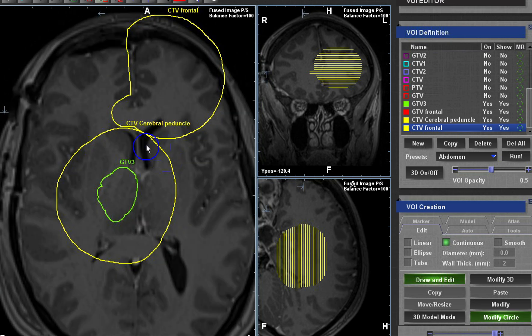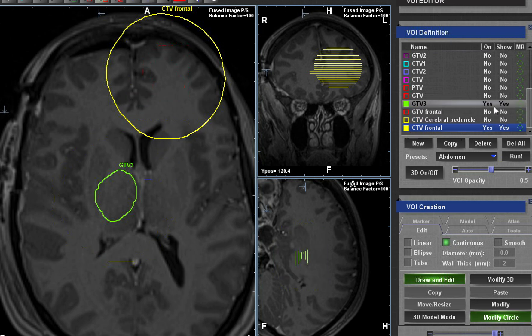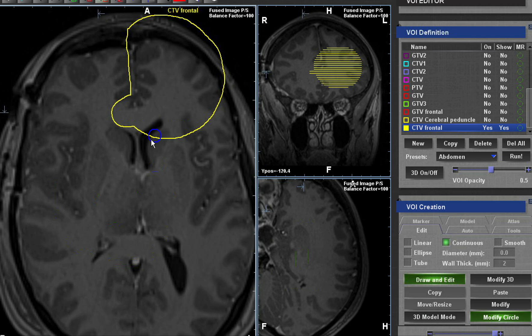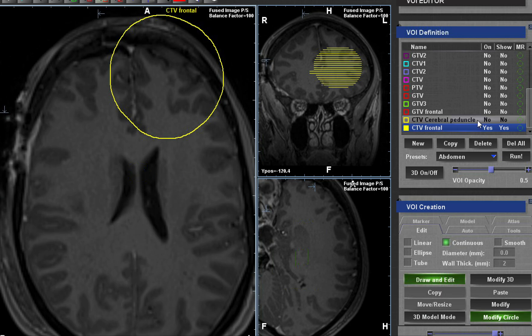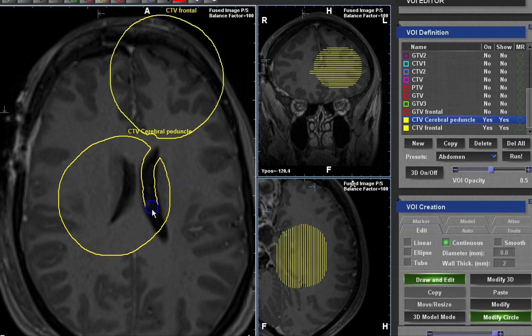Trimming at the ventricles can sometimes be overdoing things. If you trim following NRG guidelines you would trim the ventricles, but I would not do that — first because I don't want to compromise corpus callosum coverage, and second because I want the sub-ependymal tissue to be included. The EORTC recommends a half-centimeter margin around the ventricles. I usually remove the ventricle on the opposite side but not the one inside my target, as shaping around it is not practical.